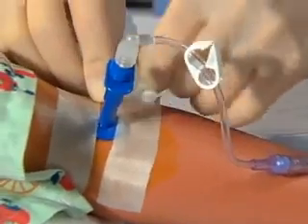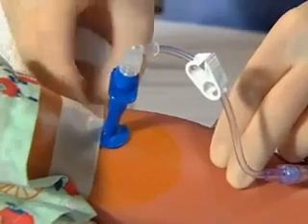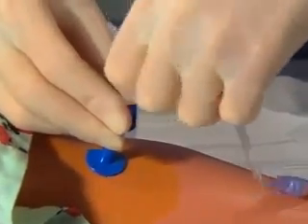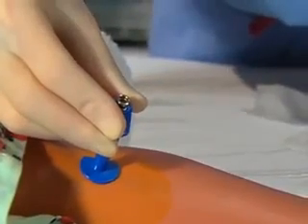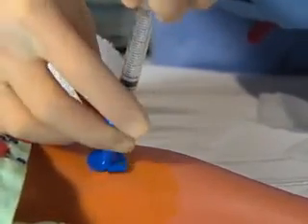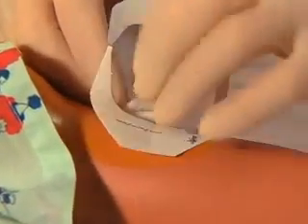The intraosseous catheter should be removed as soon as more definitive access is obtained. To remove an intraosseous needle, loosen and remove any tape or dressing securing the cannula and extension tubing from the skin. Stabilize the extremity. Firmly grasp the needle flange or connect a sterile luer lock syringe to the hub. Rotate the syringe and catheter clockwise while gently pulling the needle from the extremity. Place a sterile occlusive dressing over the insertion site.